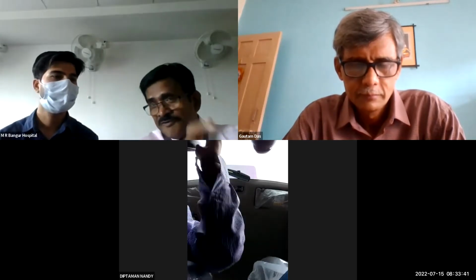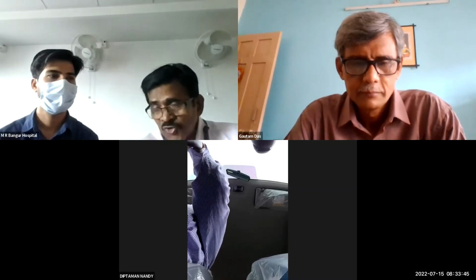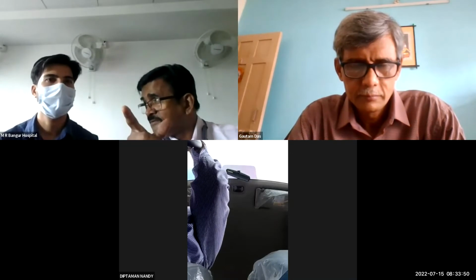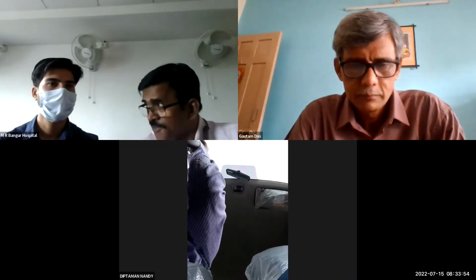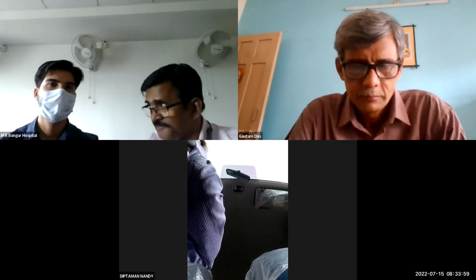You don't fit a camera? Everything is made ready. So the telescope is attached to the miniature video camera and the light cable, then you are ready. The telescope goes in, the camera doesn't go in, and you have the picture on the monitor.